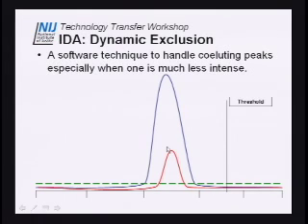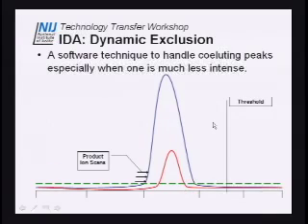What's going to happen is I'm going to produce 3 product ion scans at the beginning of my peak. Okay, I think I talked a little bit yesterday about, you may have heard me talk about, carisoprodol and alprazolam totally co-eluting with each other. This is kind of what alprazolam and carisoprodol are going to look like, with the big blue line being carisoprodol and the small one being alprazolam. What I'm going to do is get 3 product ion scans for carisoprodol, and they're going to occur here, here, and here. Okay, they're going to occur right at the beginning of the peak, because that's when that peak first crosses the green line here, which is my threshold line.